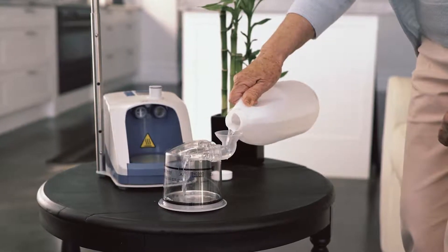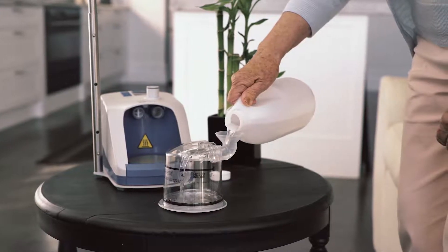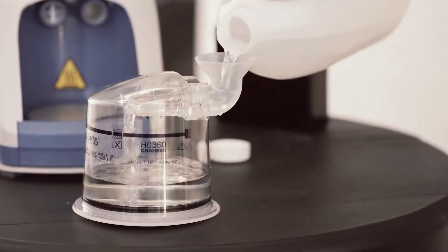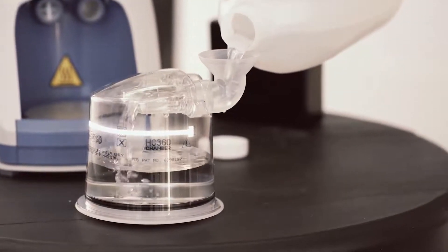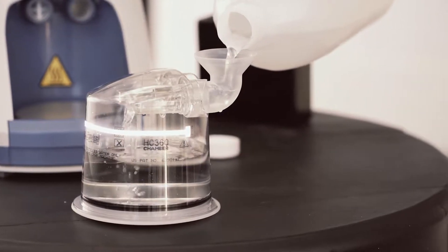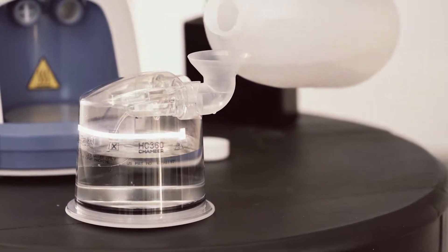With the aid of the supplied funnel, fill the chamber with enough distilled water for the period of use, but never above the maximum water level line. This is to prevent water spilling into the MyEvo2 when the chamber is installed.